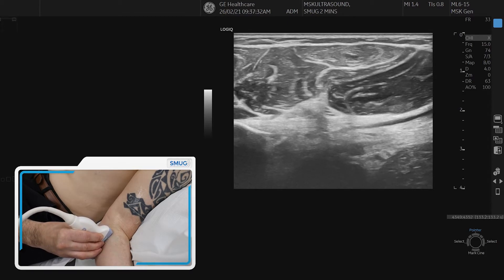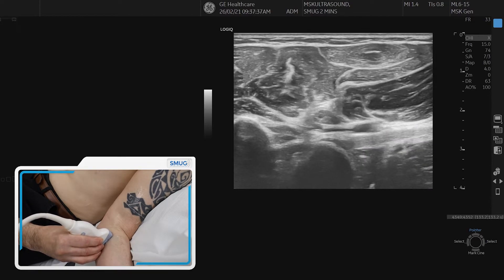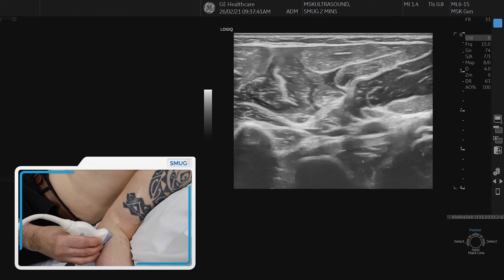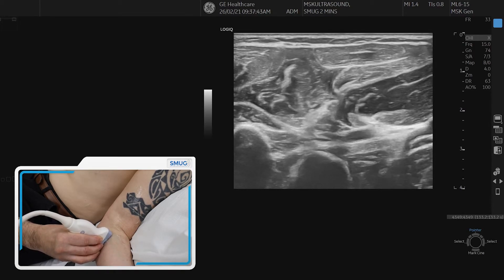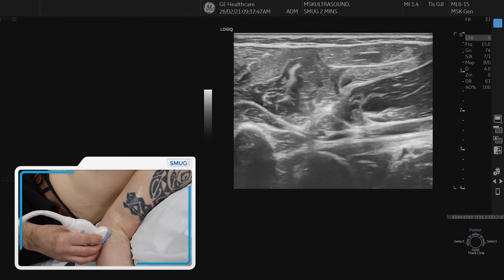The tendon usually sits deeper to the artery. Here's the tendon hitting the bone — the radius. If you rotate slowly in pronation and supination, you can follow that movement and come back to where you came from. That's a nice way to longitudinally assess the distal biceps tendon from the medial side.